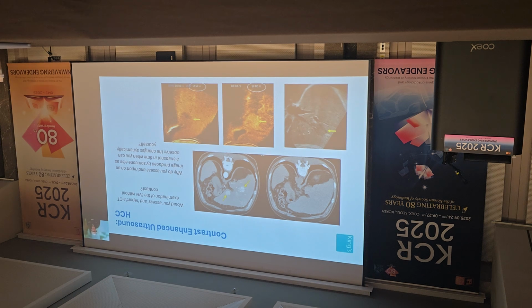Now, there are very many reasons for this, not least, of course, that you're subjecting the patient to radiation, particularly if it's a benign lesion. And benign lesions are often those that are referred by the primary care physician as an incidental lesion that will probably, in 90% of the time, be benign. So if you can assess this adequately without subjecting the patient to radiation or that volume of iodinated contrast, and give a firm diagnosis of a benign lesion such as a hemangioma, this is an asset.